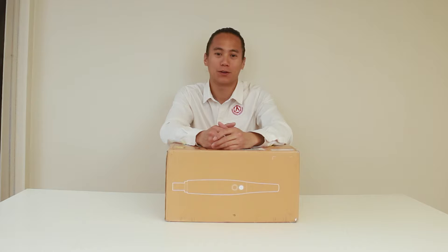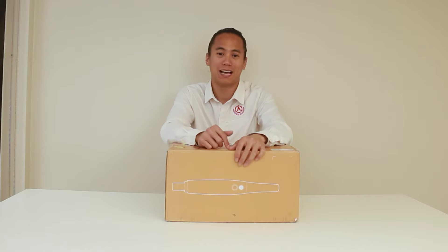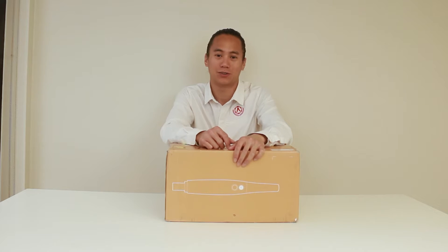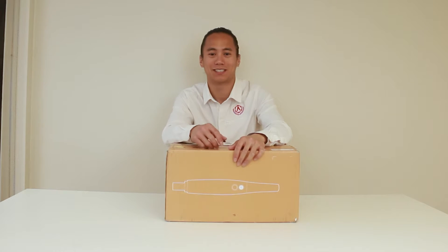Hi everyone, Andy here from Magic Academy. Today we're going to be going over the Medit i700 intraoral scanner. Let's get started.